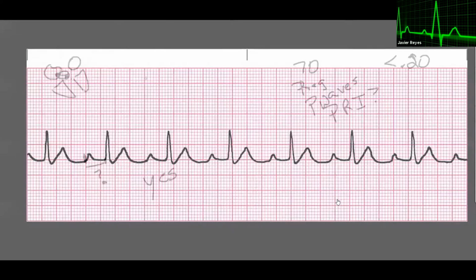No? All right, so what we did here is we just cleaned up the picture a little bit. Remember, we're talking about atrias up here and then your ventricles down here. So with this problem where you're seeing this increase in the PR interval to greater than 0.20, you're really seeing an issue with the way that electricity is being conducted between the AV and the bundle of His to get it down here to the ventricles. So if you're dealing with this, you're going to have a loss of communication or a drop or a sustained drop in communication between the atrias and the ventricles.